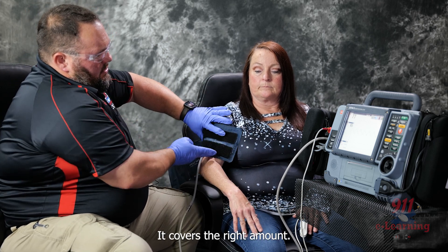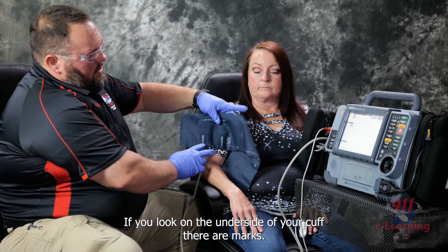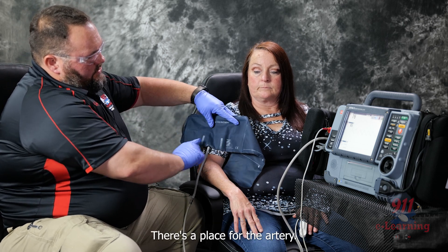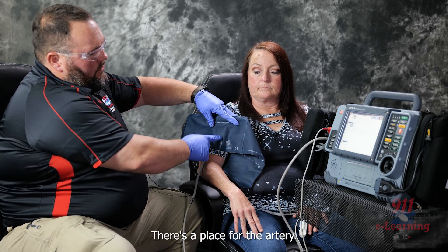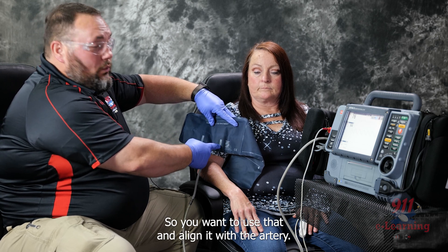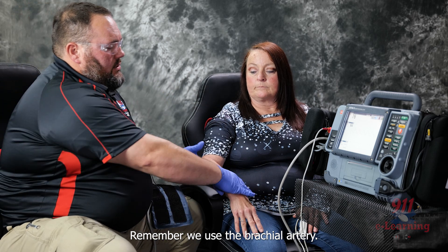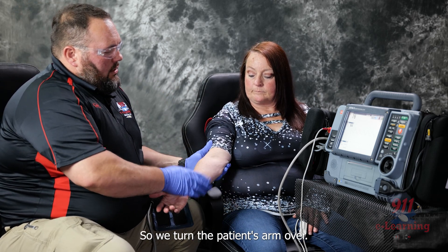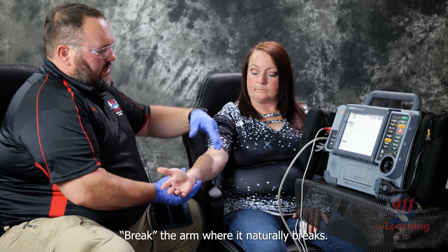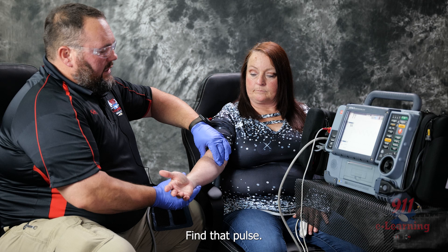The regular adult cuff covers the right amount. If you look on the underside of your cuff, there are marks and a place for the artery, so you want to align it with the artery. We use the brachial artery, so we turn the patient's arm over. Break the arm where it naturally breaks — that's where that artery is. Try to find that artery and find that pulse.